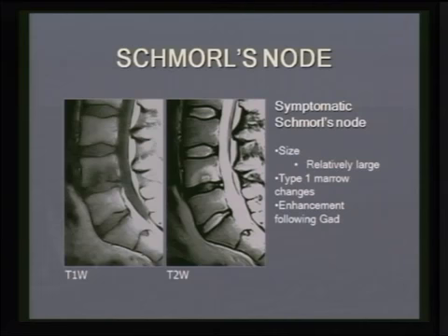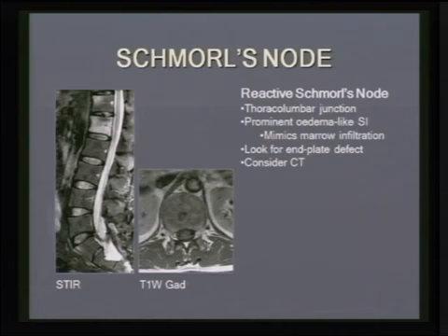But when we see a relatively large Schmorl's node, particularly when it's associated with the type 1 reactive end plate changes, it may well be a cause of low back pain.